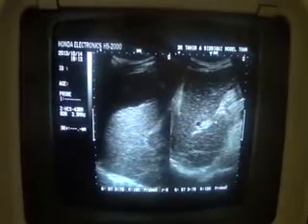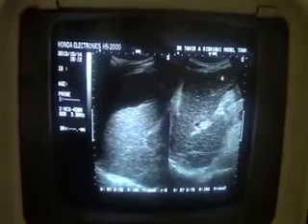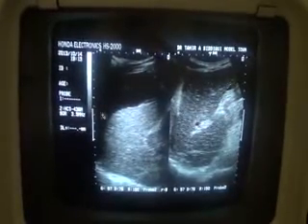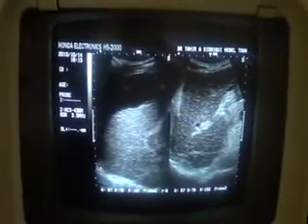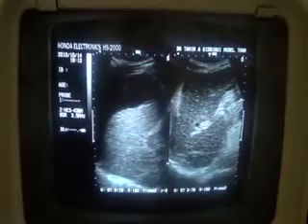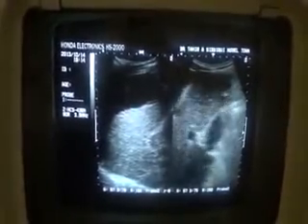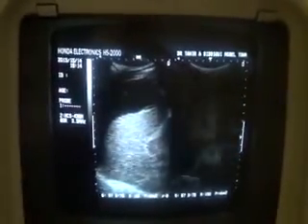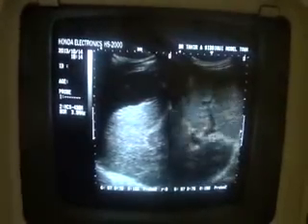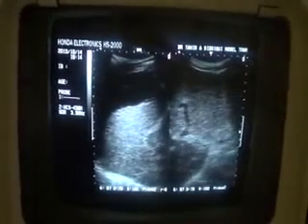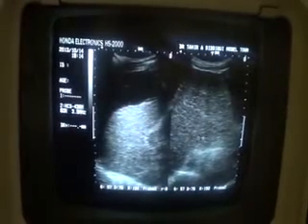This is the caudate lobe. This is the ligamentum venosum. This is the left lobe of the liver and this is the right lobe of the liver. This is the hemidiaphragm. It is better to report what we are seeing. This is the transverse section of the left lobe of the liver.